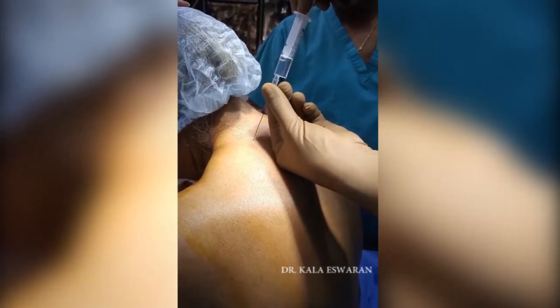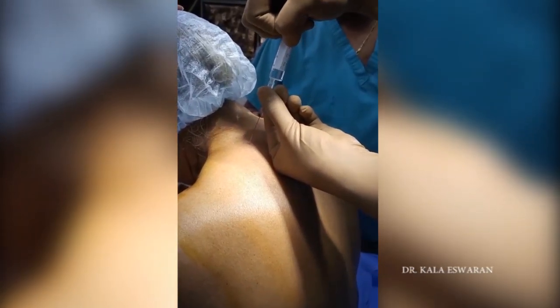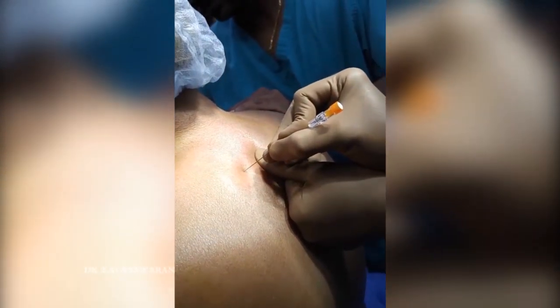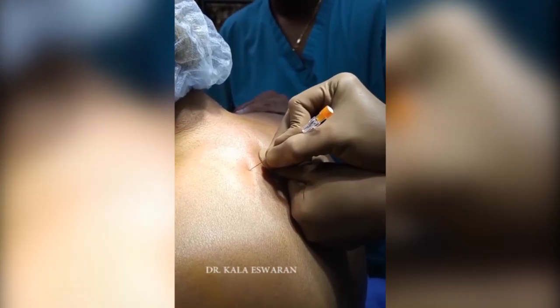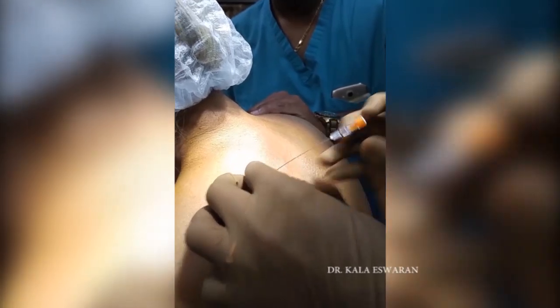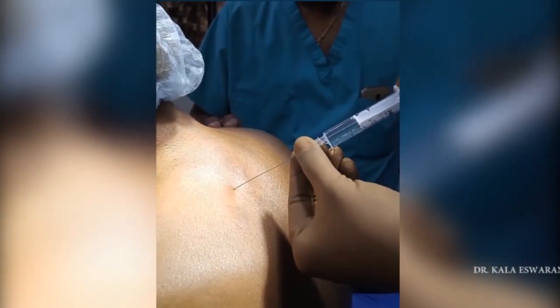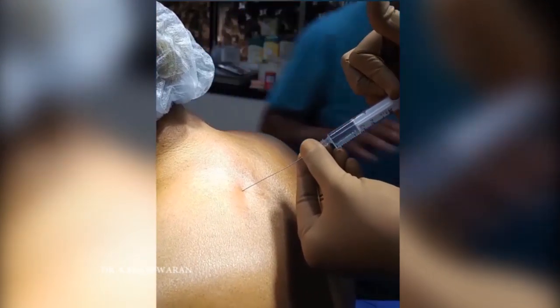Injection is performed with intermittent aspiration for blood. The same technique is repeated at the level beneath, that is, the T2 side. You can see the giveaway of the superior costotransverse ligament. Again, 3 cc of the LA mixture is injected after negative aspiration for blood.